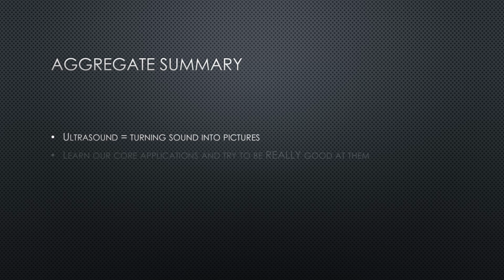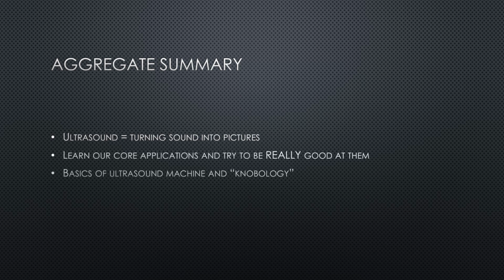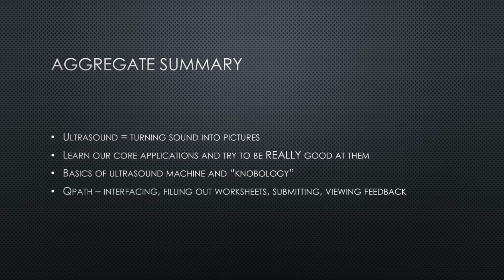So aggregate summary, right? Ultrasound is turning sound into pictures. I want you guys to learn our core applications, try to be really good at them. We talked about the basics of the ultrasound machine, using the ultrasound machine and knobology so you can get really good pictures. We talked about QPath, how to interface with it, filling out the worksheets, submitting and viewing your feedback. And I hope you guys are ready to scan.